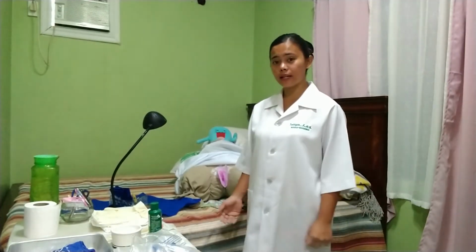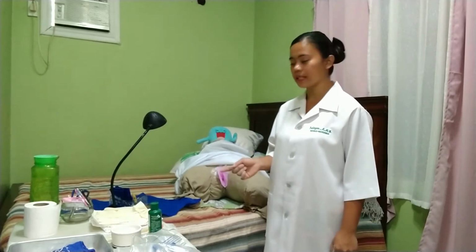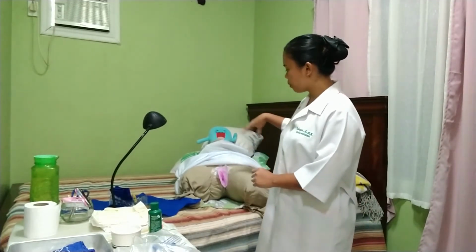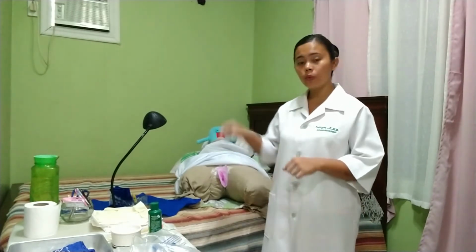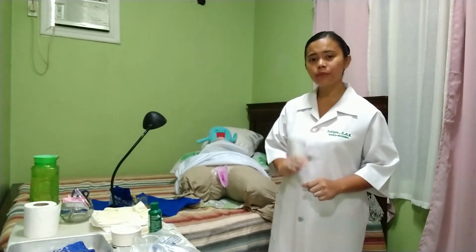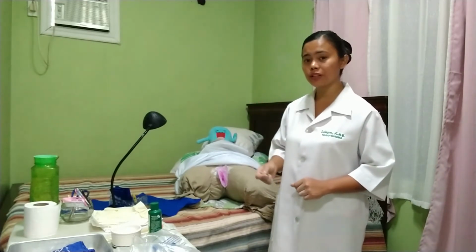Now that our sterile catheterization kit is open, we can now get the drapes and tuck it under the patient's buttocks and of course over the patient's abdomen, plus the fenestrated drape later on. So when taking things in the sterile catheterization kit, we have to make sure that we are only touching the sides. That way we can protect the sterility of our field.